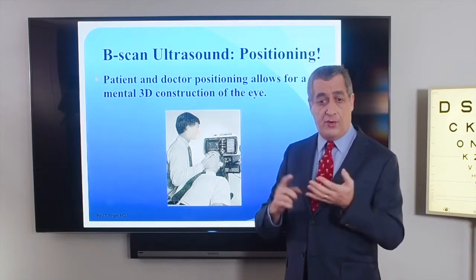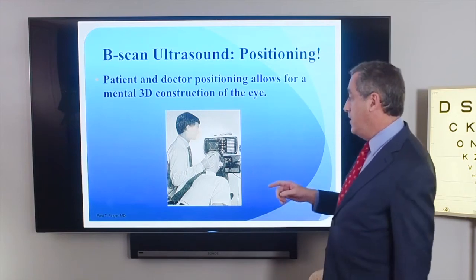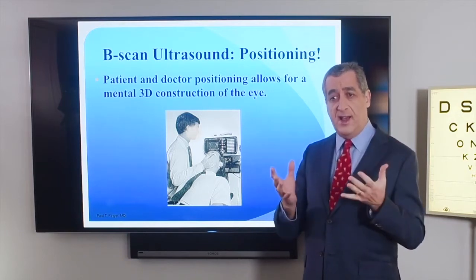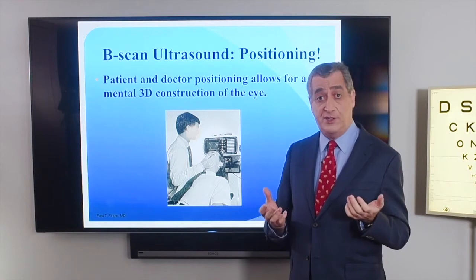But we need a third instrument to do that, and that's our brain. Now, in order to take a two-dimensional cut through an eye, or multiple two-dimensional cuts through the eye, and process that, we have to optimize our clinical situation.